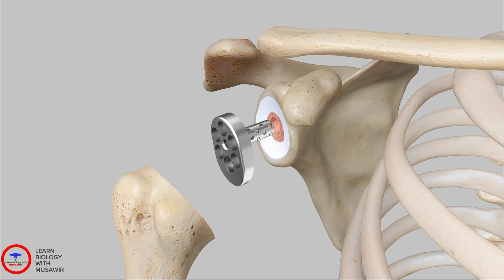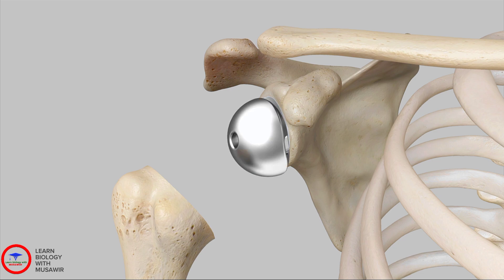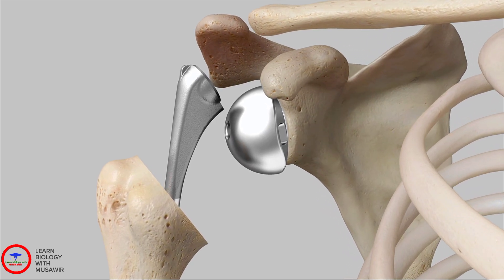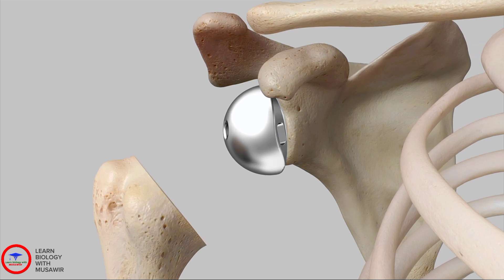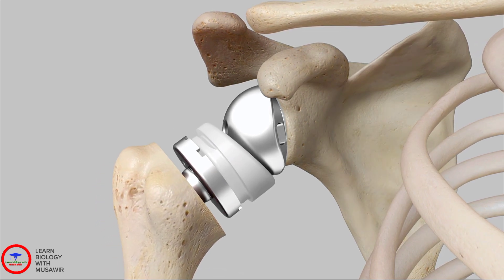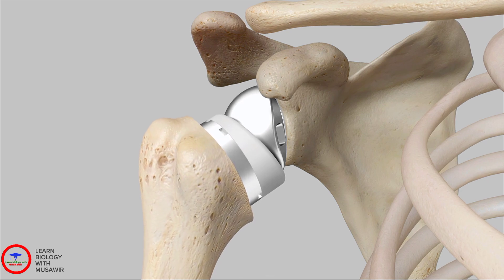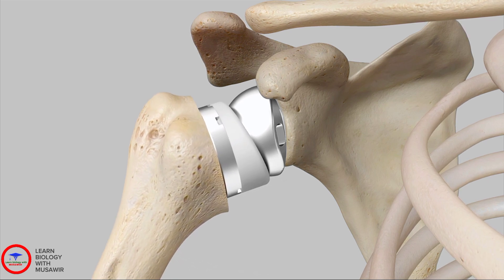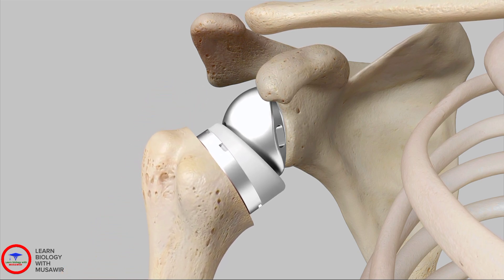A glenoid plate is inserted to act as a base for the metal ball (glenosphere). A metal stem is then cemented or press-fit into the canal of the arm bone, depending on the surgeon's preference. The metal ball is fixed to the socket, and a plastic component, the humeral liner, is fixed to the upper end of the humerus, essentially reversing the ball-and-socket joint's original position.